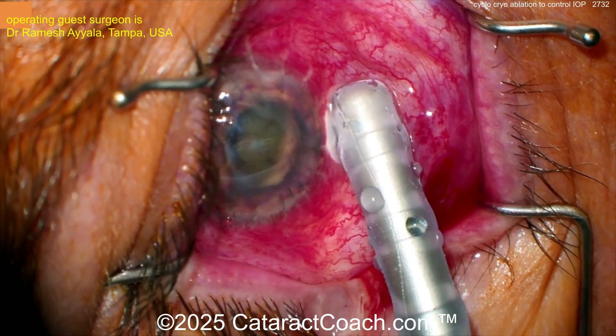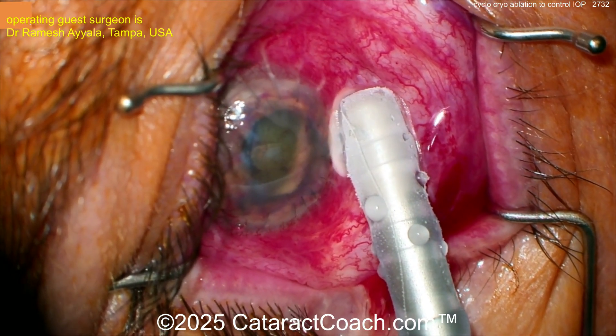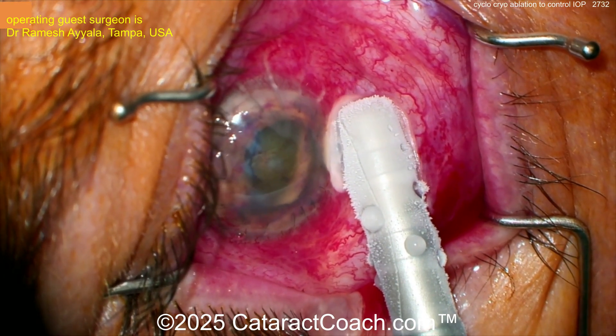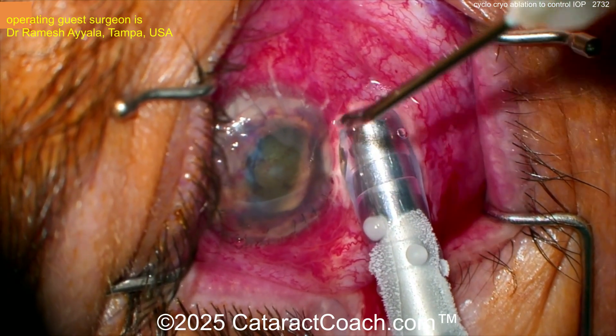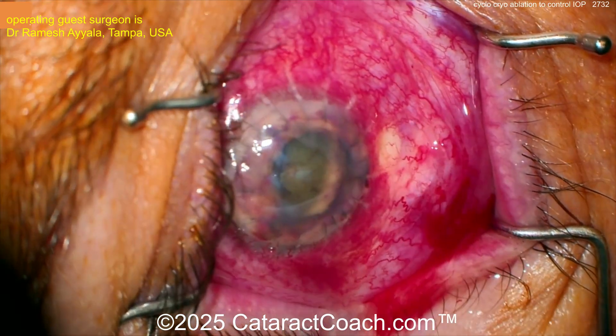You're going to do about four or five of these spots on the inferior 180 degrees. Don't go 360 — you're just doing the inferior 180. That's 30 seconds per spot; the video is sped up, so remember it's 30 seconds for each spot. You can time it exactly for more accuracy. There's the big freeze ball that you create.